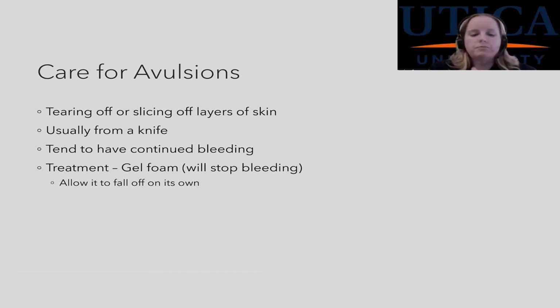So one thing you can do, this is my newest trick: they have these little tourniquets that you can put on fingers, or you can make a tourniquet to put on a finger. So you can tourniquet the finger and get it to stop bleeding. That's the one thing, get it to stop bleeding. Obviously don't leave it on there for a long period of time, just a short period of time.